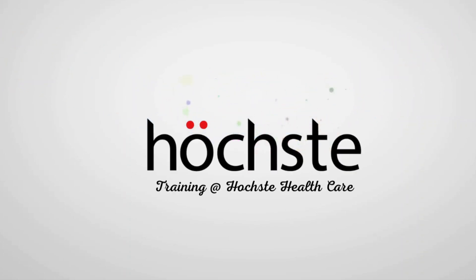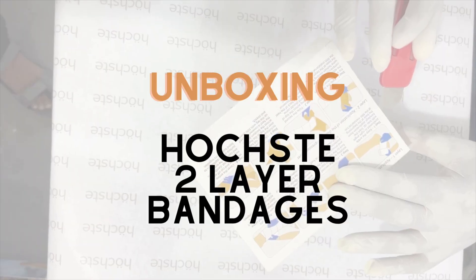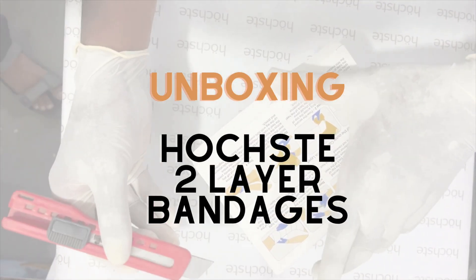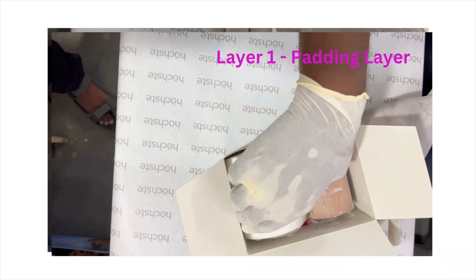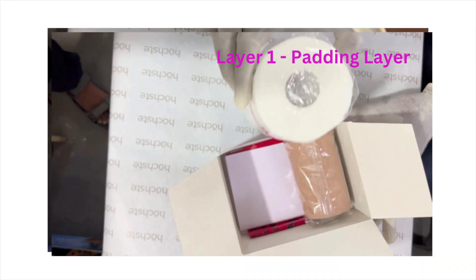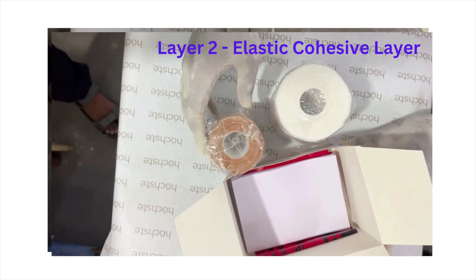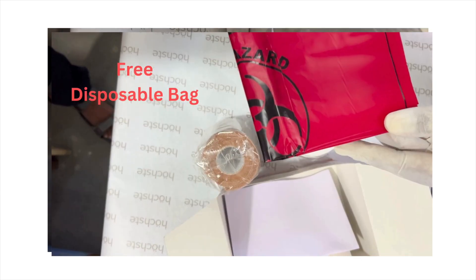Welcome to Hosh Tay Healthcare. In this video, let's take a look at unboxing of the Hosh Tay 2-layer bandaging system. Layer 1: Padding Layer. Layer 2: Elastic Cohesive Layer. Free Disposable Bag.